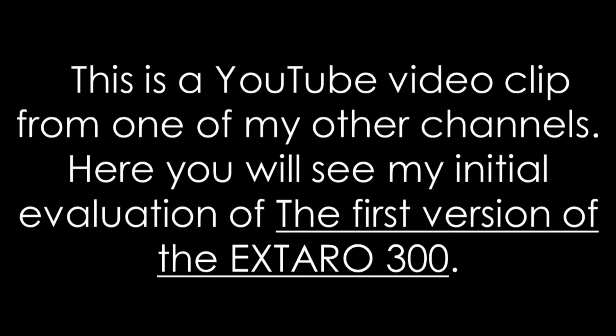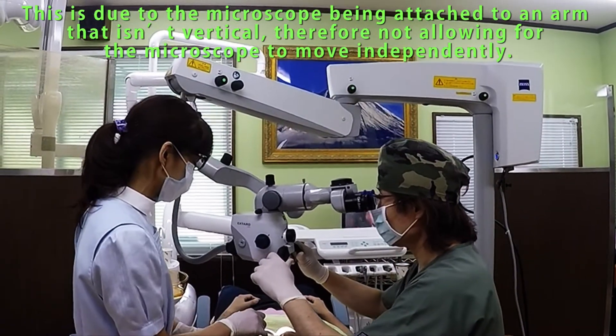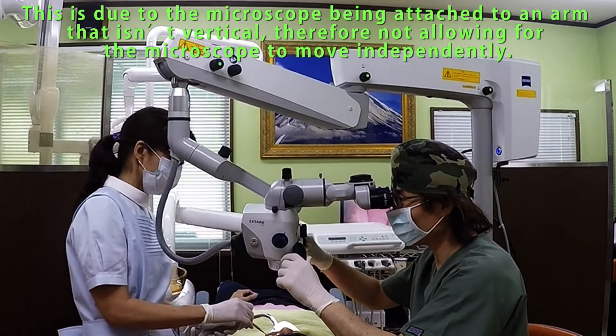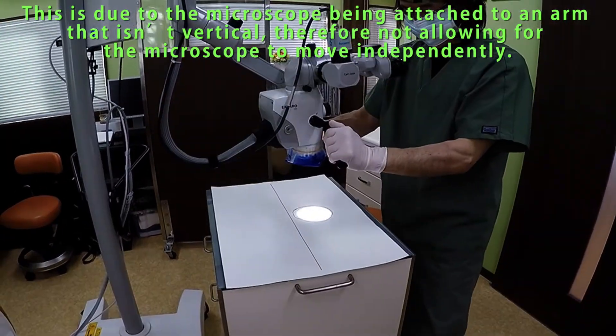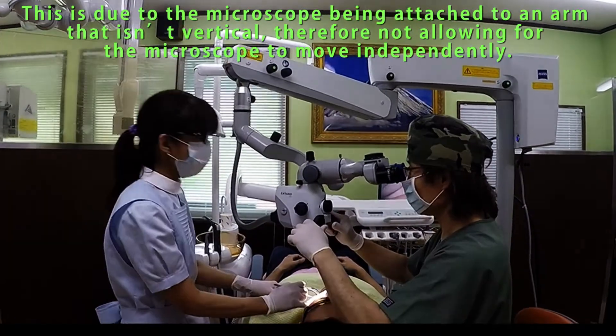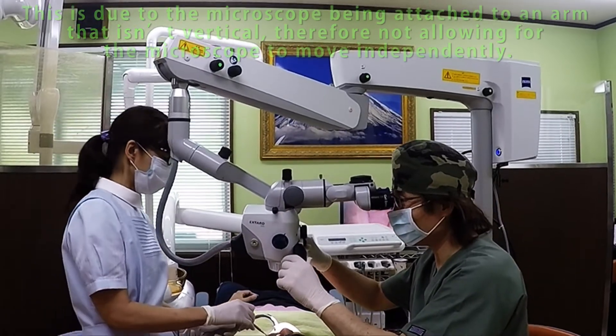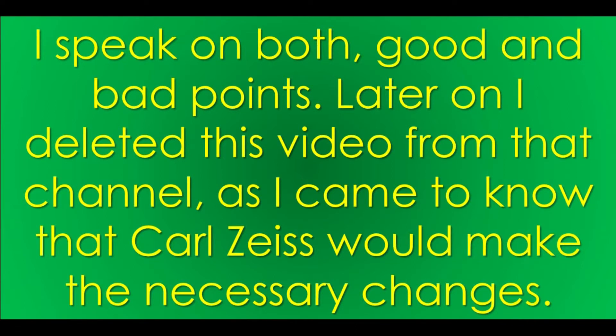This is a YouTube video clip from one of my other channels showing the initial evaluation of the first version of the EXTARO 300. This is due to the microscope being attached to an arm that isn't vertical, therefore not allowing for the microscope to move independently. I spoke on both good and bad points, then deleted this video from the channel as I came to know that Carl Zeiss would make the necessary changes.